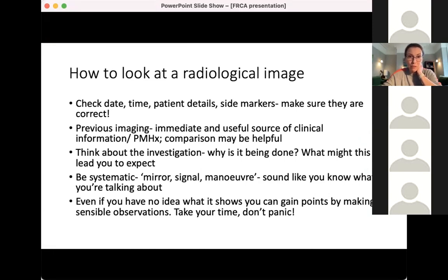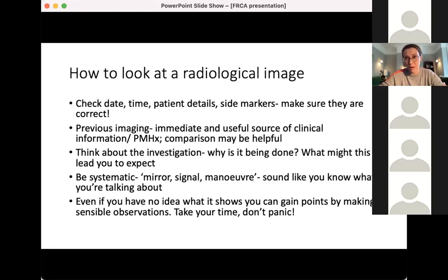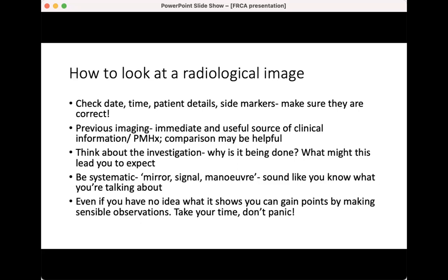First and foremost, make sure you're looking at the right image for the right patient at the right time. Check side markers — they should be on a film, either CT or plain film. Consider any previous imaging provided. Think about what you're looking at, why it's being done, and what the clinical scenario is, as this guides what to expect from the film.